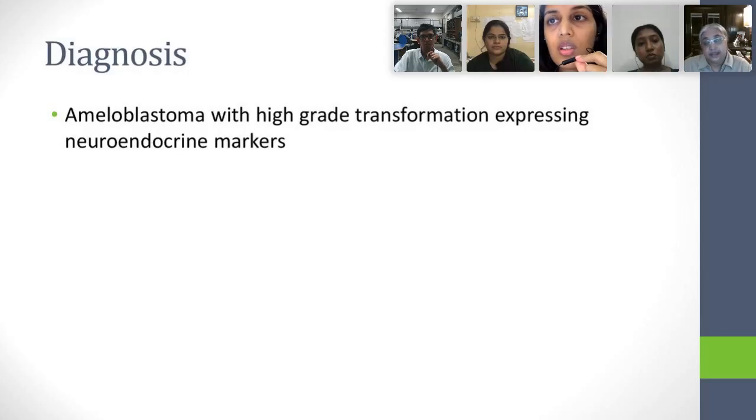Anything that becomes very highly malignant, or shows a high grade transformation, may show you some neuroendocrine markers. You see it in high grade prostate cancers, you see it sometimes in high grade adenocarcinomas, whether of the lung or the GI tract or whatever. It's an adenocarcinoma, but when you do find neuroendocrine differentiation on immunohistochemistry, this does not look in any way like a neuroendocrine tumor. It doesn't look like that at all. You may see neuroendocrine differentiation.